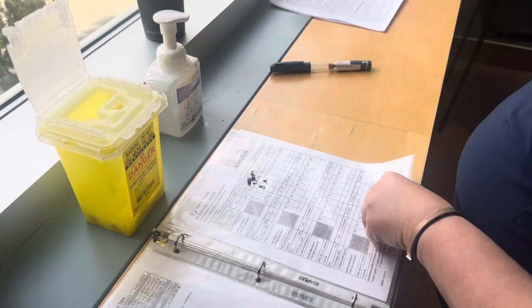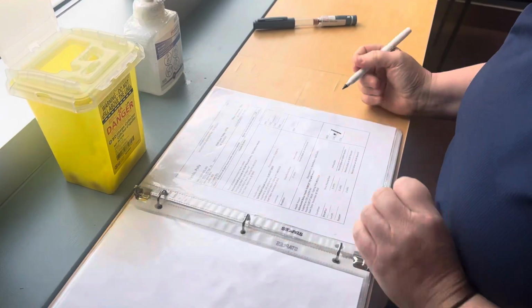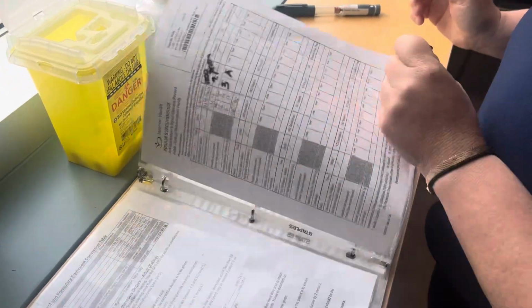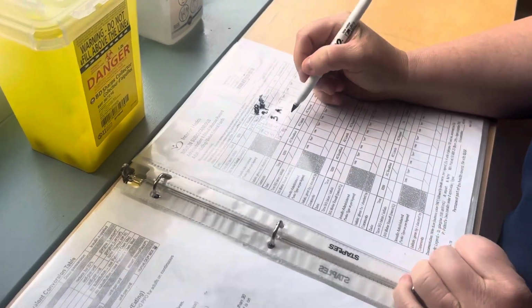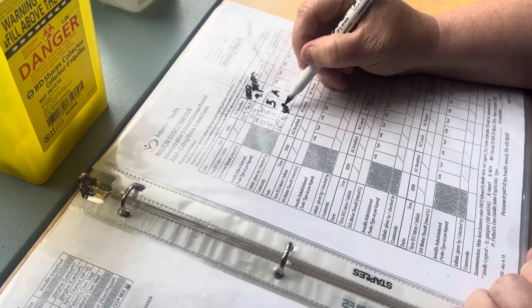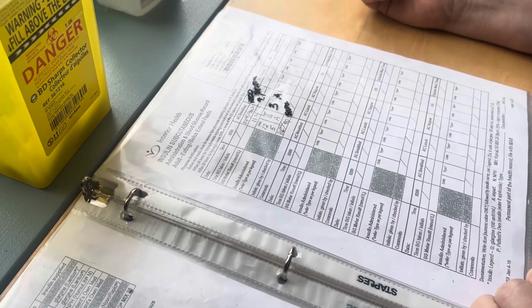Okay, so that was the 12:30 dose. Like I said, that's already been checked off independently. I will check this off here that I gave 3 units of aspart. And then after that was given, my independent double check would sign off on it as well.